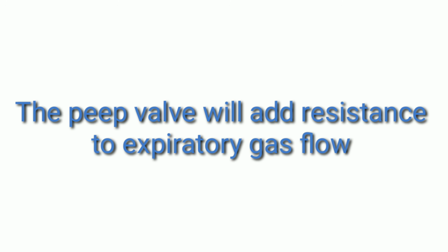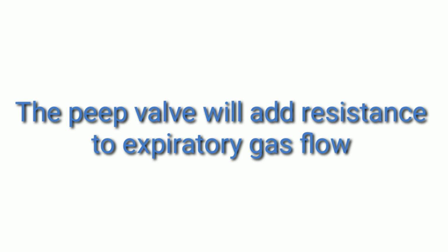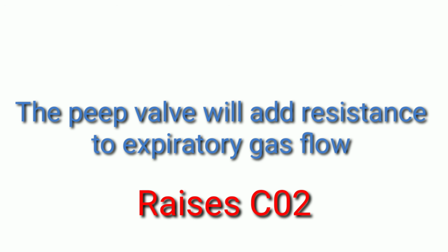So if this is creating resistance, it means that during that brief drop, where, like I said, we're trying to help evacuate a lot of the CO2, if that brief release has any amount of resistance, which is going to happen with the PEEP valve, you're limiting the amount of CO2 that can be excreted because you're creating back pressure because of the valve.